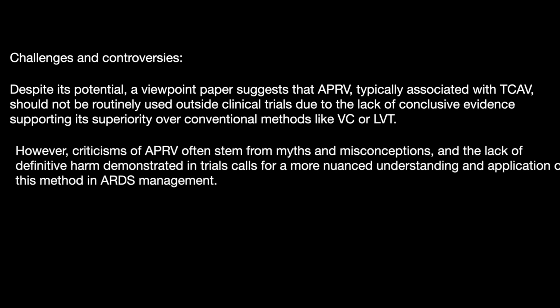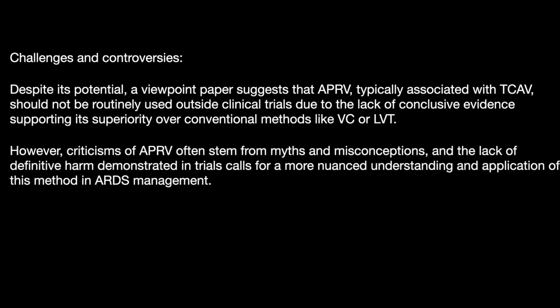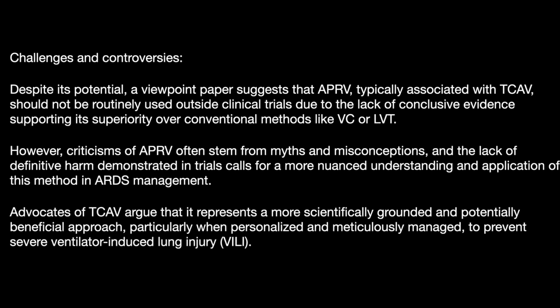Now, what are the challenges and controversies? Despite its potential, a viewpoint paper suggests that APRV, typically associated with this time-control approach, should not be routinely used outside of clinical trials due to lack of conclusive evidence. However, the criticism of APRV often stems from myths and misconceptions, and the lack of definitive harm demonstrated in trials calls for a more nuanced understanding and application of the method in ARDS management. Advocates of the time-control approach argue that it represents the most scientifically grounded, potentially beneficial approach, particularly when personalized and meticulously managed to prevent VILI.